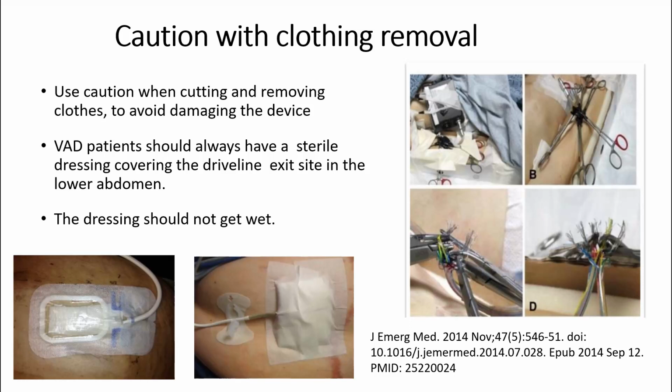So here's the really cool thing. Imagine being in the ER for this. They present him into the ED. The ER physician whipped out half a dozen forceps. Probably the janitor probably saved the day as well. Stripped the wires, spliced them back together, and got the pump working again. Got the controller communicating with the pump itself. And the patient restored perfusion, and he did quite well.